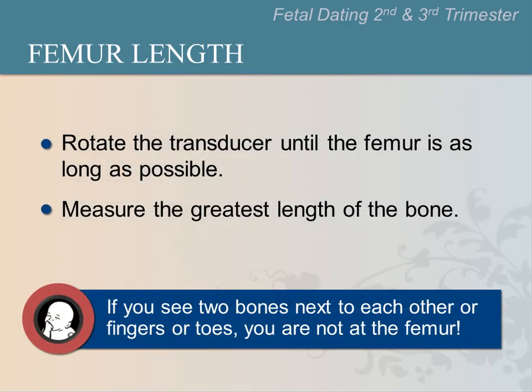To properly measure the femur, rotate the transducer until the femur becomes as long as possible. Please ask your trainer to demonstrate this with a doll. If you see two bones next to each other, or fingers or toes, then you are not at the femur.